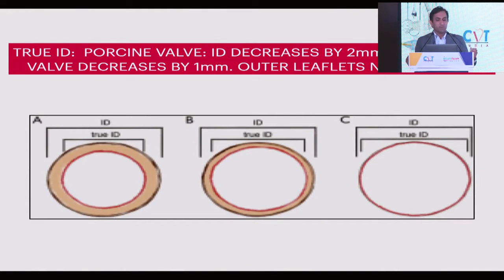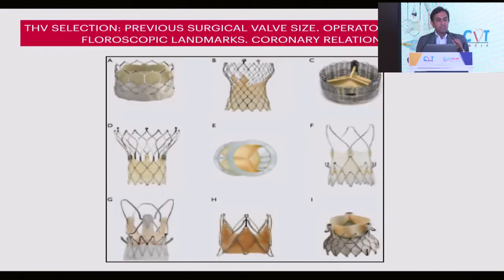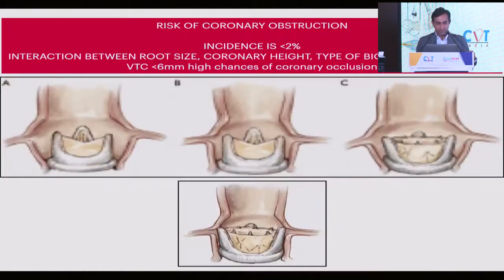And there is a bioprosthetic tissue valve where the leaflets are on the outside, so there is no decrease in the ID. THV valve selection, very important. Previous surgical valve size, we need to understand. Then the operator experience or expertise, fluoroscopic landmarks of the valve, and coronary relationship. These are the things which we need to know even before we plan a transcatheter valve-in-valve procedure.